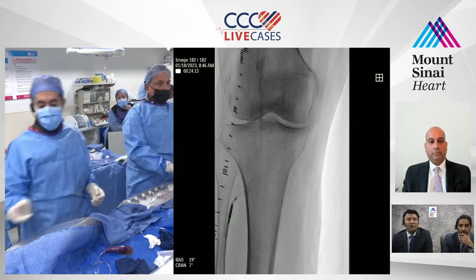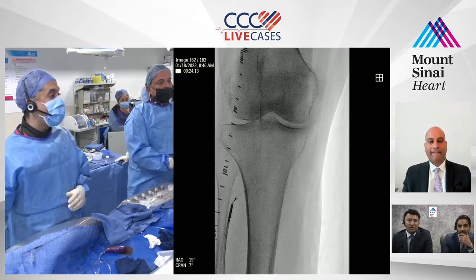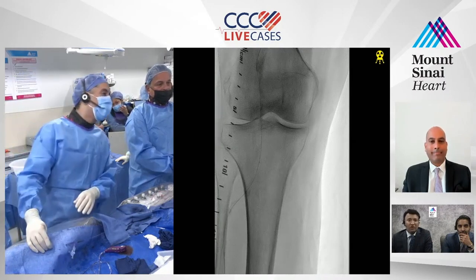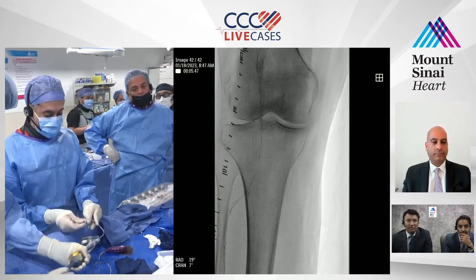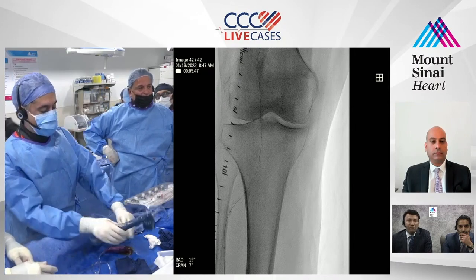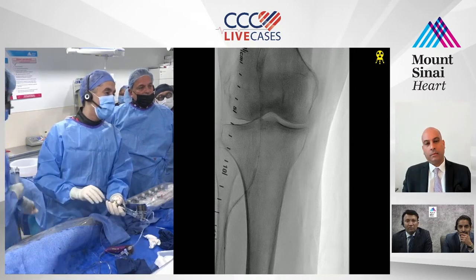But the question is, you don't want to put another sheath because now you're again staging the process, right? As Srini wanted to do from the beginning. Yeah, but if you can cross it with a micropuncture access, take it out, balloon it, do a Shockwave in the common femoral, finish the case off today itself. Well, like I said, we'll have a discussion, but let me at least balloon this, and then once we cross, you know, see, there's the lesion.